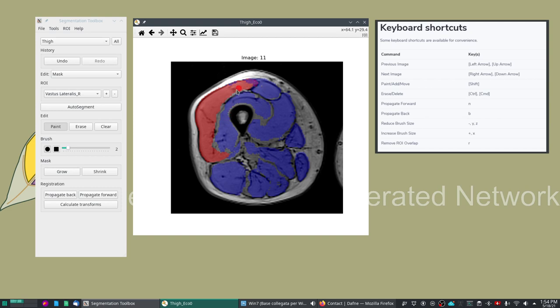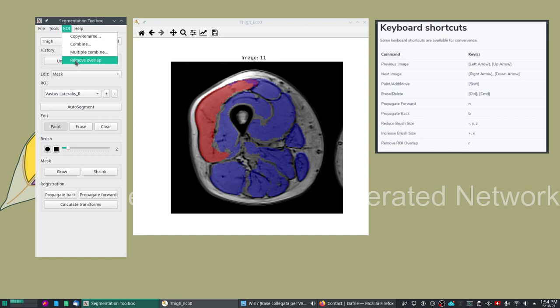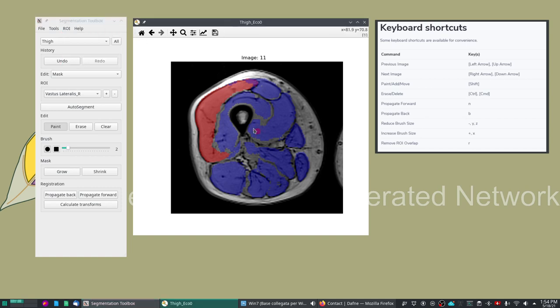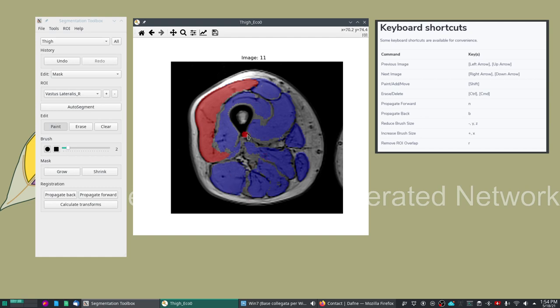Now I've painted over and the software by itself doesn't mind if there is overlap between ROIs, but we can click on ROI remove overlap or press the R button to make the overlapping ROIs go away, so only the ROIs that overlap with the currently selected ROI go away.